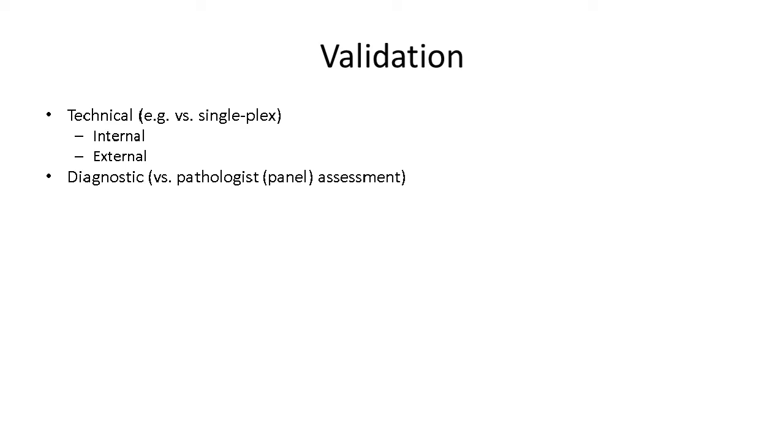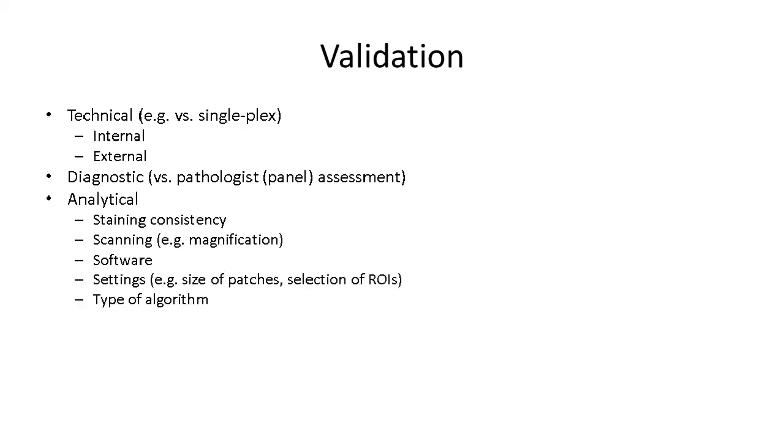You also have to validate it against the singleplex staining, as I mentioned earlier. So you need to be sure that what you're looking at in multiplex is actually a true representation of the singleplex staining. You also have to perhaps think about validating it against the pathologist assessment. So if you're using these AI approaches, you need to be sure that if you're going to use that in a diagnostic setting, it's at least as good as a pathologist in doing the same sort of assessment.